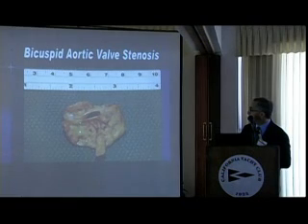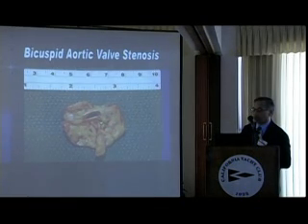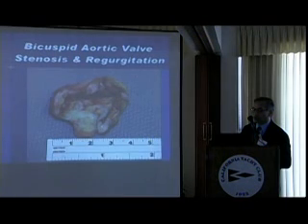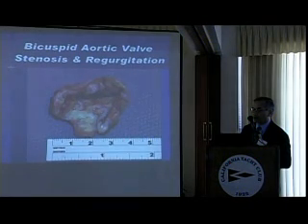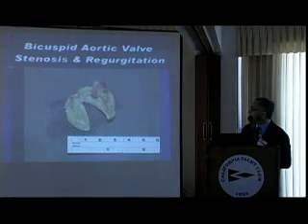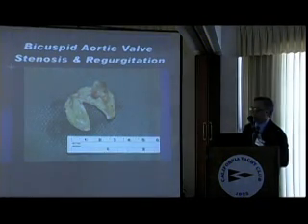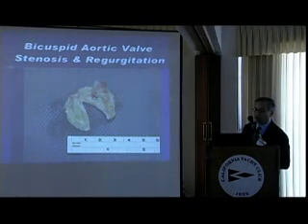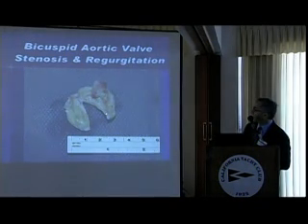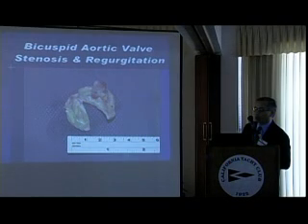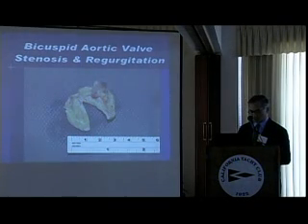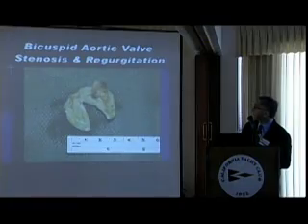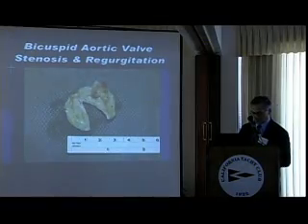Similar situation — you can see a lot of calcium deposits. This is just a different form. In this valve, there is moderate calcification of the aortic valve, and there is relatively a better opening. These patients can have a combination of leakage as well as stenosis.